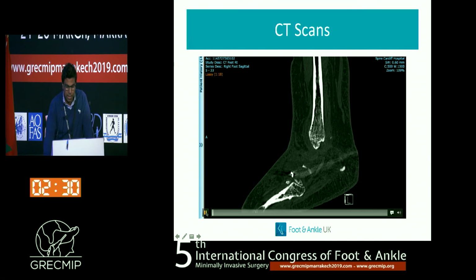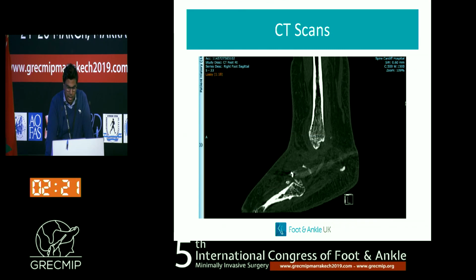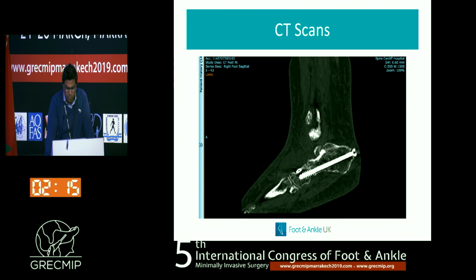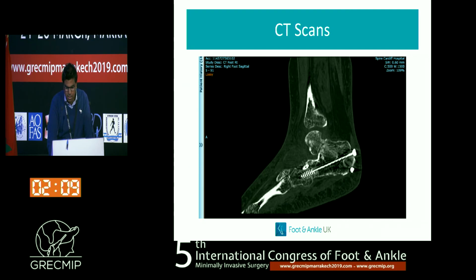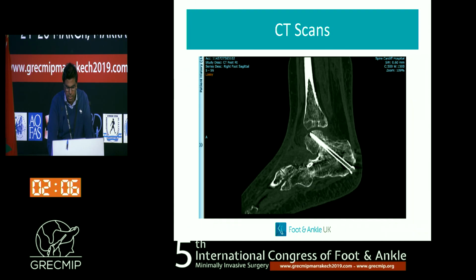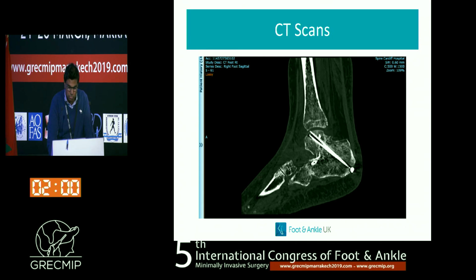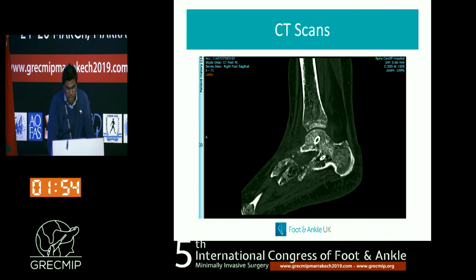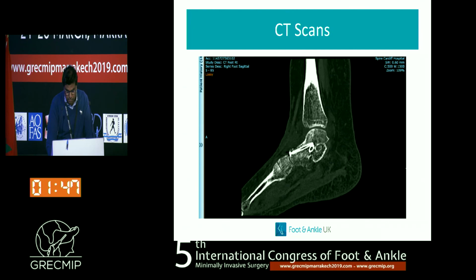And to give you an example of a patient, this is a patient I operated on for a tarsal coalition on the 3rd of October, and the CT scan is the 5th of December, and this is actually a patient where 2 of the screws were malpositioned. But if you look at the calcaneal cuboid joint and then come through into the posterior facet, bear in mind this is at 8 weeks post-op and she's been walking in a boot. That screw tip was actually not evident on the X-rays at all. But I was able to remove that screw at 8 weeks because I knew that there was a full fusion present. And the fusion mass is really good, and it goes right through to the middle facet and across the talonavicular joint.